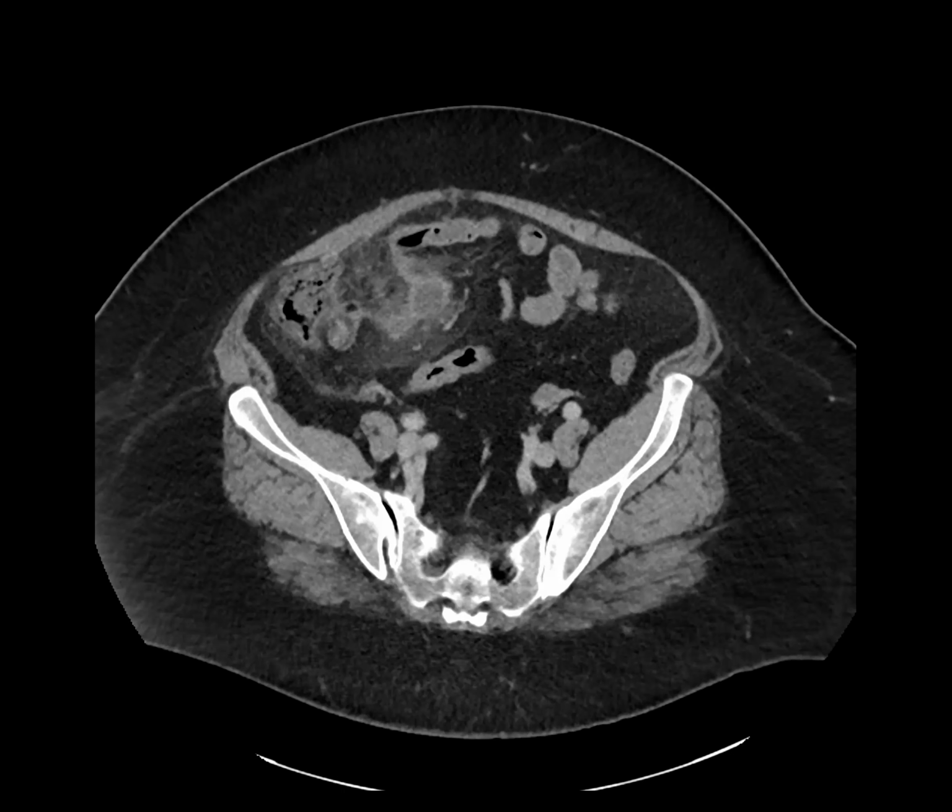Meckel's scan is very, very good. So it's 100% sensitive and specific for Meckel's diverticulum that contains gastric mucosa. So like we said, only 60% contain gastric mucosa. So that means there's going to be a lot of false negatives, right? Because if it's not gastric mucosa, Meckel's scan is going to be negative, and cannot exclude non-gastric mucosa containing Meckel's.